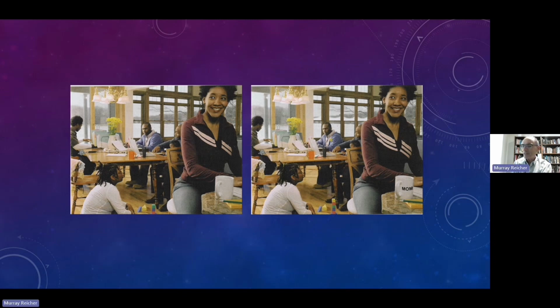When I mention reading informed by cognitive science, I want to show you some examples. So here we have two images that are displayed side by side. This is a setup that is way more ideal than the typical radiologist ever encounters, because these images are scaled to the same size, they have the same grayscale, and there's only two of them. Whereas a radiologist trying to compare a new CT to an old CT might have hundreds or even thousands of images to compare. And yet, it's a tough task, right?